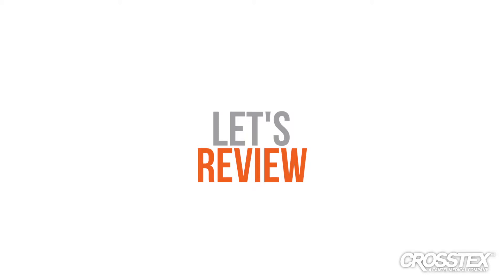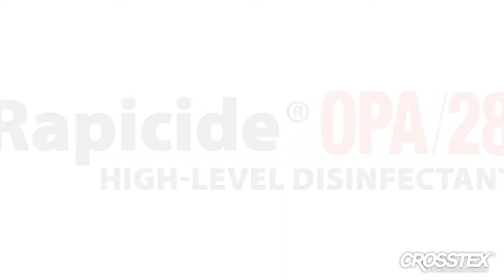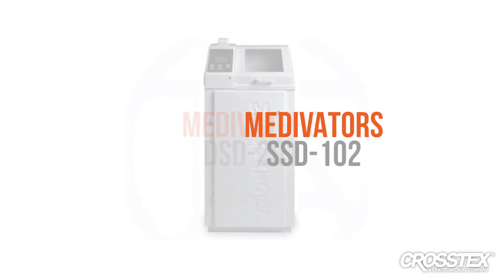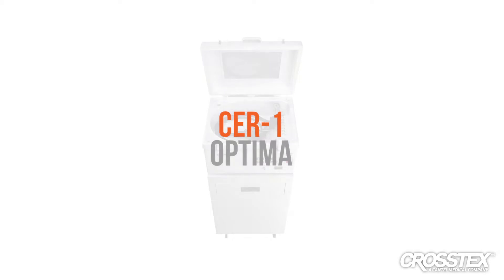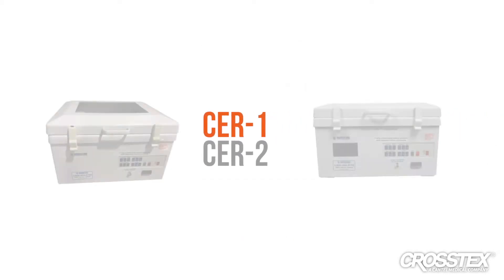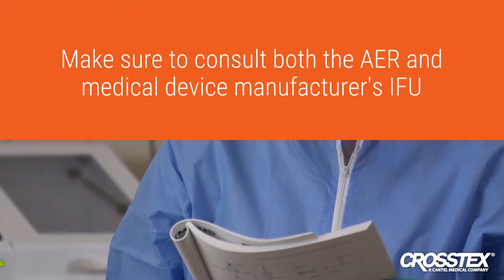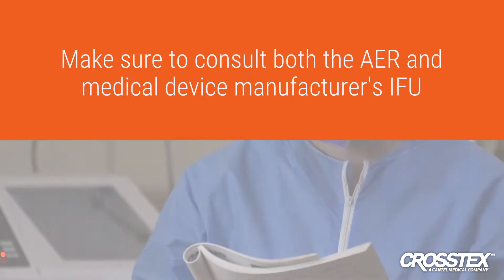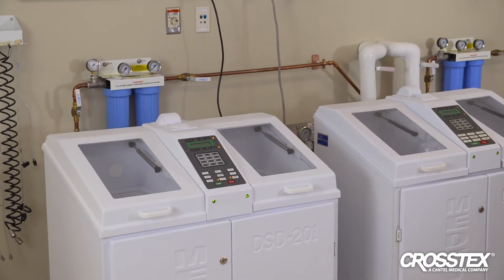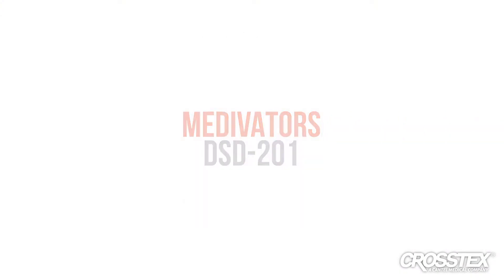Let's review the change-out and disinfection procedure for Rappaside HLD when using an AER. Rappaside OPA28 has been validated for use in the Medivators DSD-201, SSD-102, CER1 Optima, CER2 Optima, CER1, and CER2 automated reprocessors. Make sure to consult both the AER and medical device manufacturer's IFU, which must be read prior to use. In this example, we will be using the Medivators DSD-201 dual basin AER.